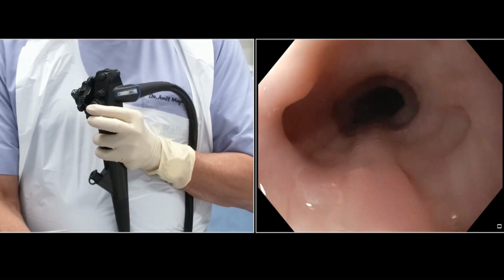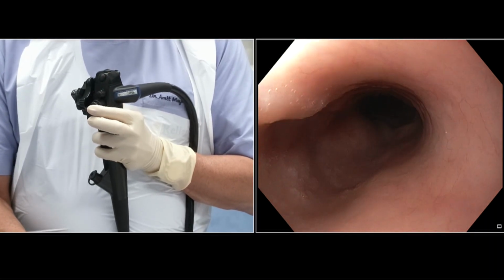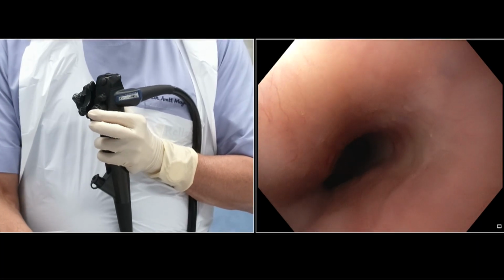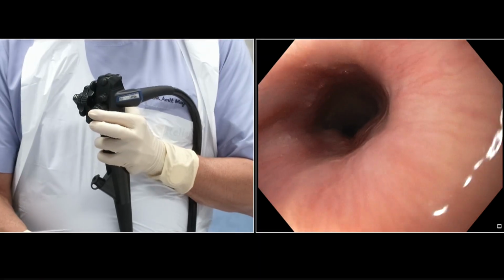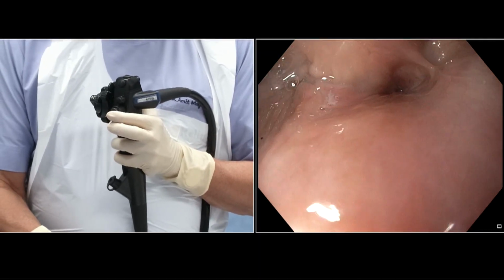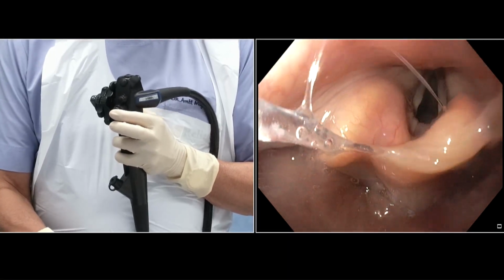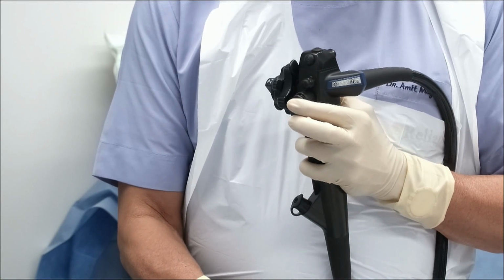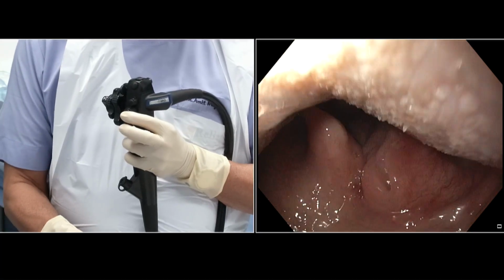This small nodule does not require any biopsy. It is a submucosal bulge which is seen, very tiny one, doesn't require any further investigations. Gently pulling the scope out into the cricopharynx. And once we come back to the cricopharynx, we suck out the fluid which is there accumulated in the throat, which is around the cricoid cartilage. Once more you can inspect the cricoid cartilages, the vocal cords if required, and then gently pull the scope out.